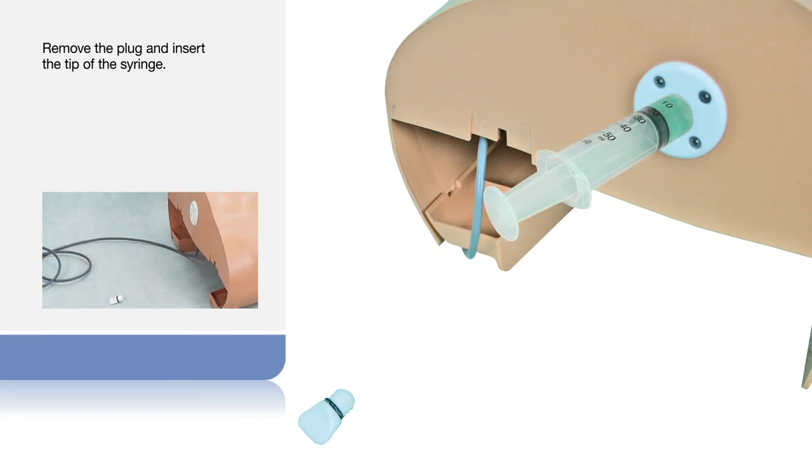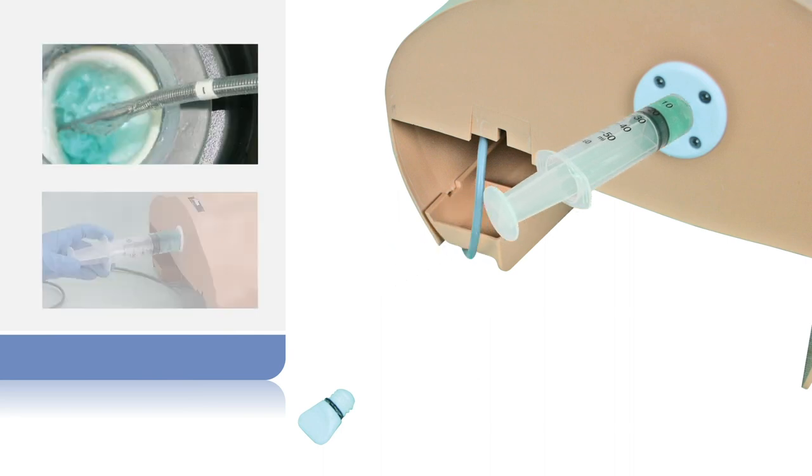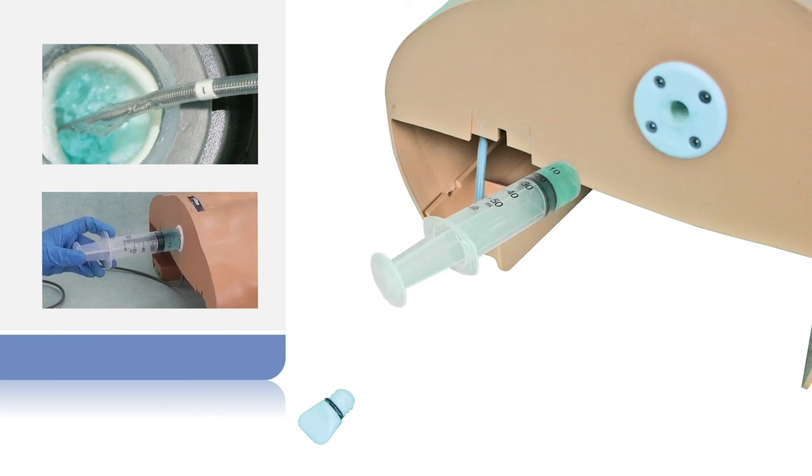Gently push the syringe plunger until gel starts to appear at the esophageal opening. Remove the syringe and reinsert the plug.